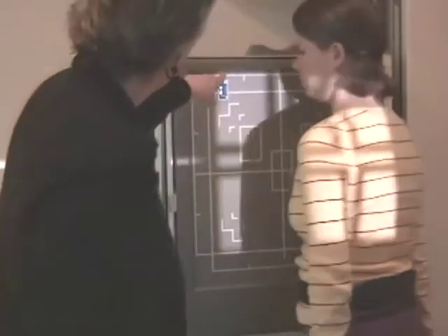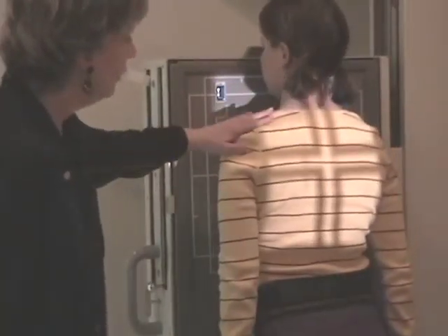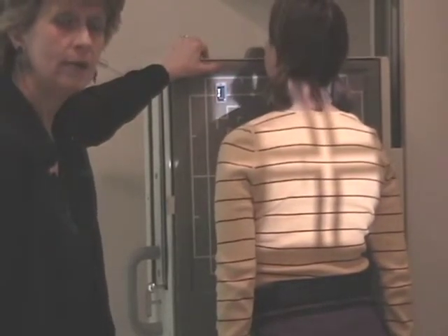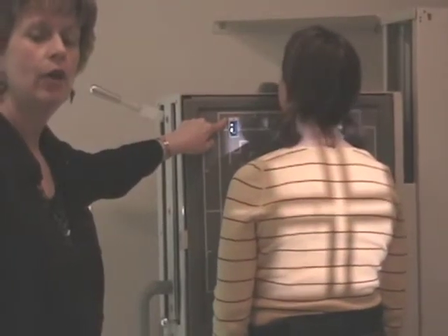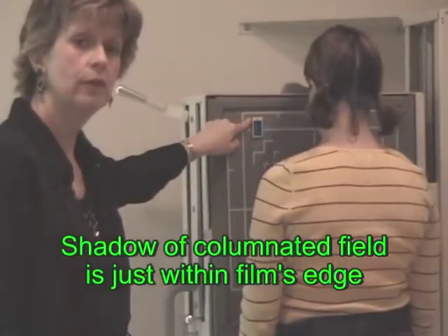And you can have your patient step back, or you can leave your patient there and actually use, you know where that light was when you first set it up. So I know that I'm going to have to lower it to bring it back into the same relationship that I had in the first place. And again, the shadow of the collimated field is just within the film's edge. Okay.